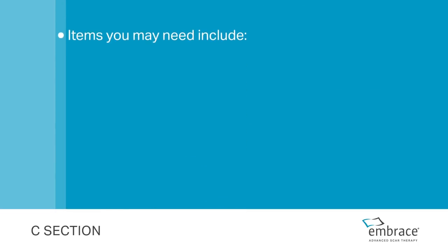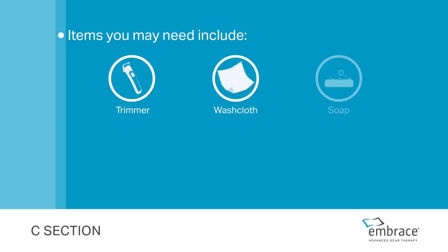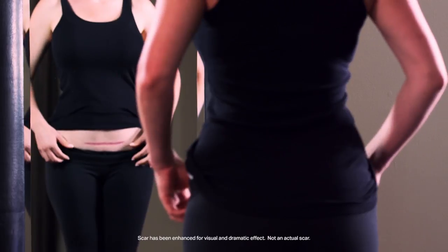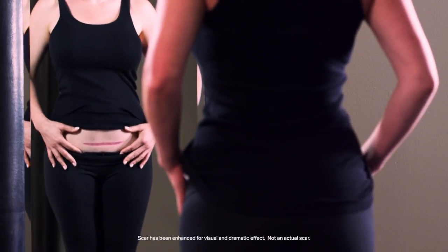Items you may need include a trimmer, washcloth, soap, alcohol wipes, and mirror. Use a mirror for guidance and avoid bending to look at your scar while applying Embrace.